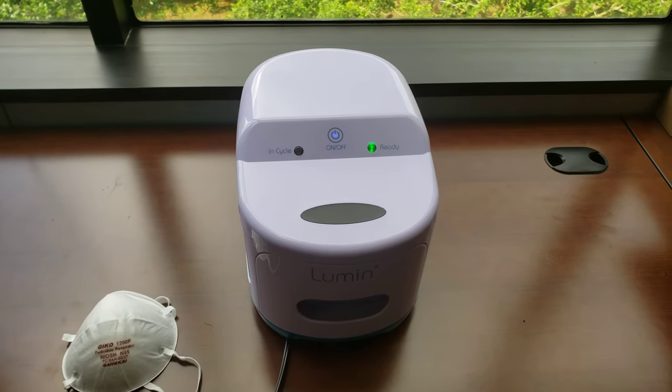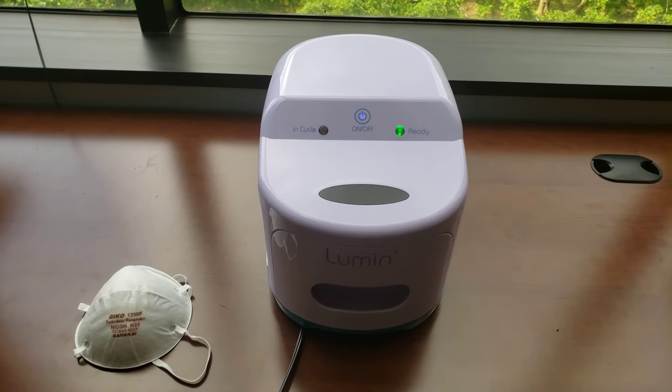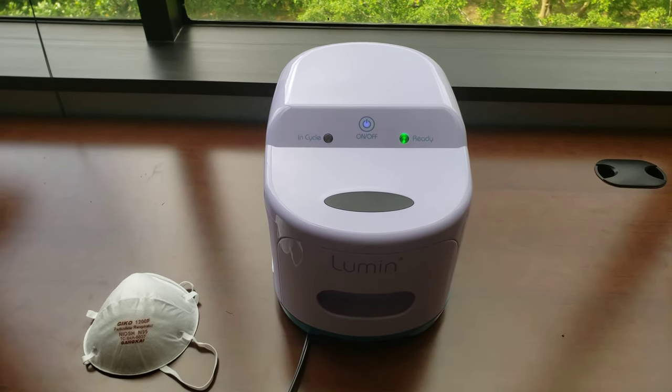This is the Lumin Sanitizer. This uses UVC to sanitize anything you need, from your cell phone to your N95 mask.